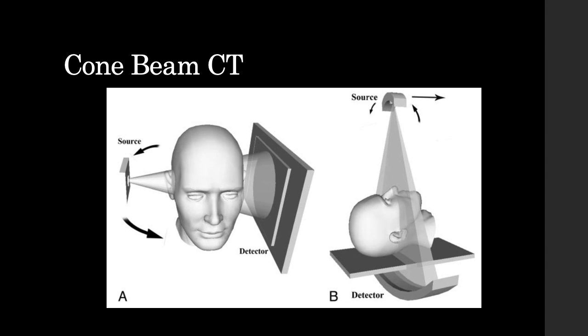And then you have detector elements in your detector that detect in both the X and Y direction, so rather than just being a single pixel that takes a value in its defined space from the fan beam, it will take signal from the X and Y direction, so you get this really rapid image acquisition. This is of course fantastic for small parts, and like I say, it's used mostly now for dental X-ray and extremities like wrist and ankle, because of the decreased examination time, which also leads to a decrease in movement artifact, and also an increased X-ray tube efficiency.